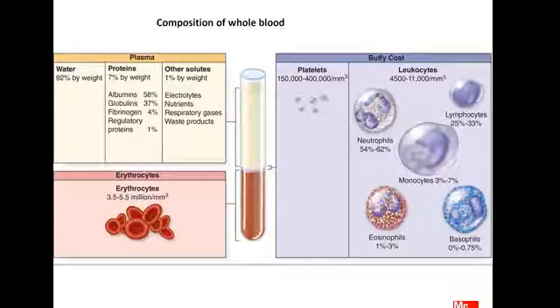The first cell is the neutrophil, with fine pink granules in the cytoplasm, while the granules of the eosinophil are bright pink or red, coarse granules, while in the basophil there are coarse purple or blue granules in the cytoplasm.